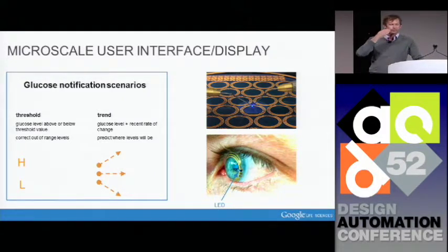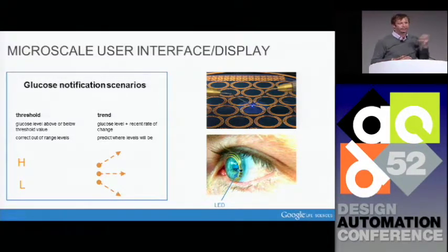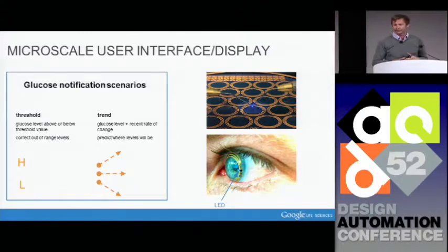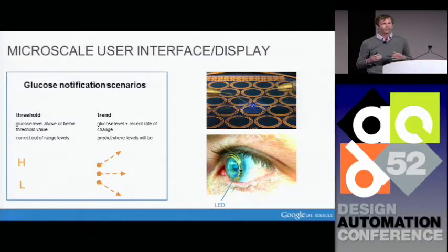Focusing on something on the surface of your cornea is extremely difficult. So that's one of the challenges that we have. But there are a few different ways that we can use this technology if we're able to integrate light sources onto the contact lens. Even just a handful of LEDs, it doesn't need to be presenting a coherent image immediately. It can be thresholding. Different color LEDs that could give you high and low if you've exceeded or gone below certain predefined thresholds of glucose.